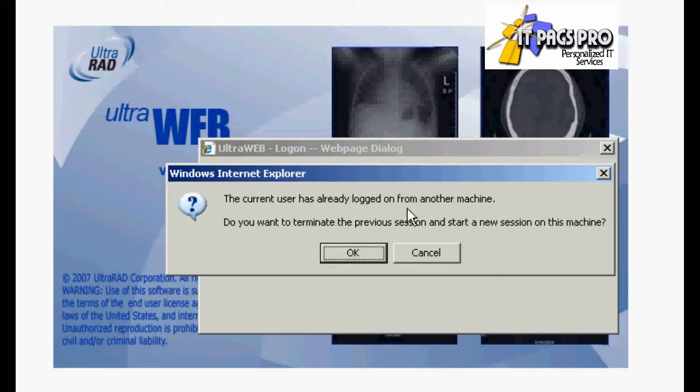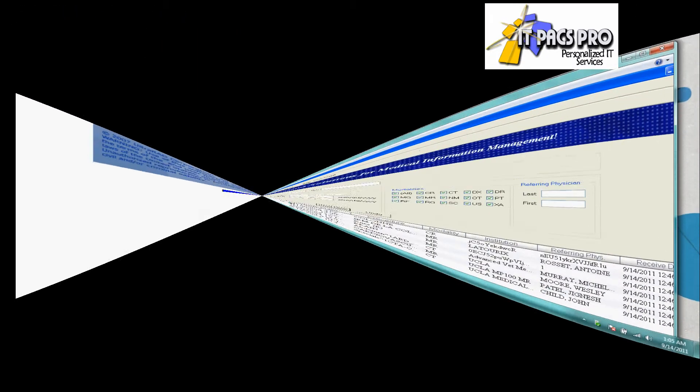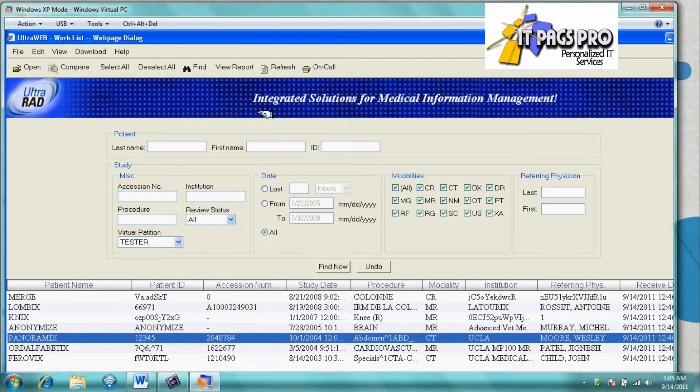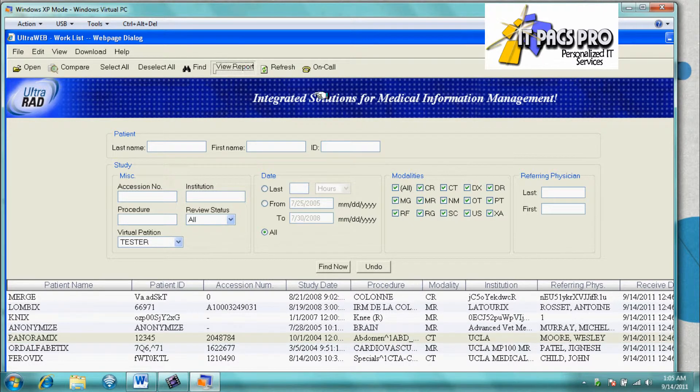Here we are logging into the software. We have the daily worklist, and we can click View Report.